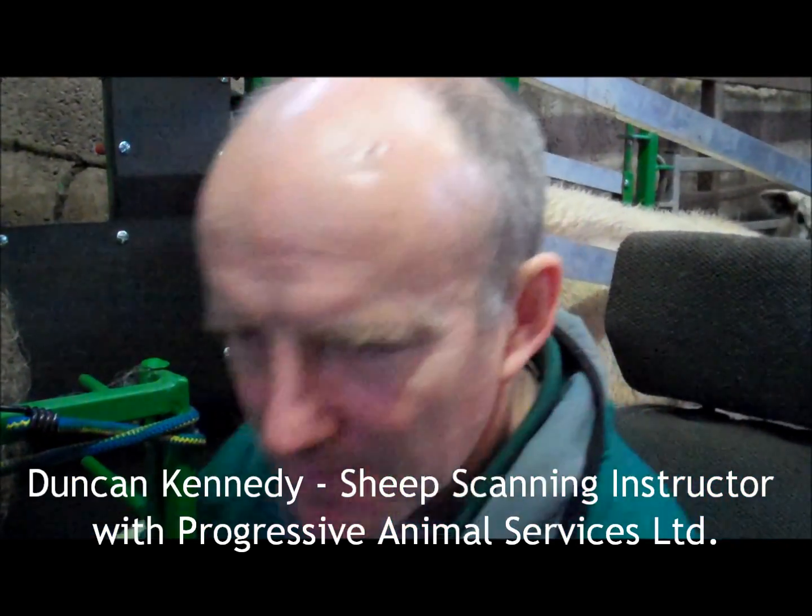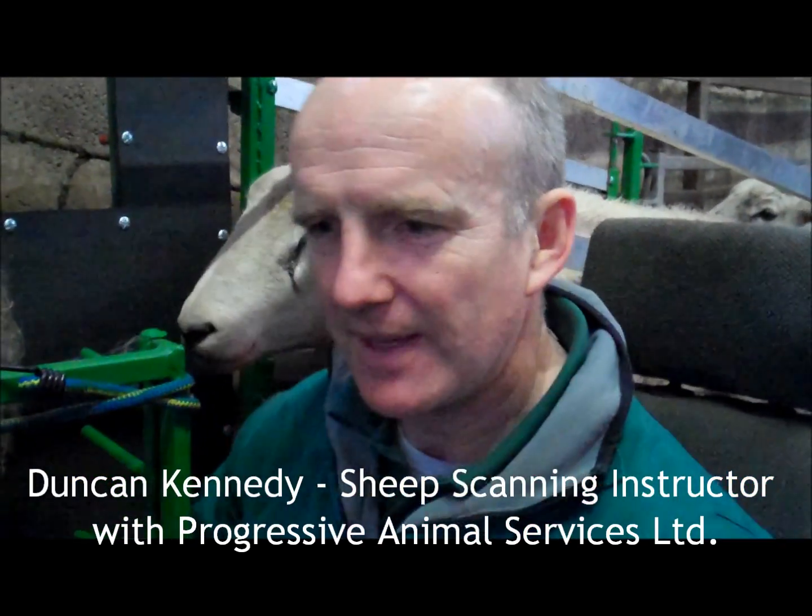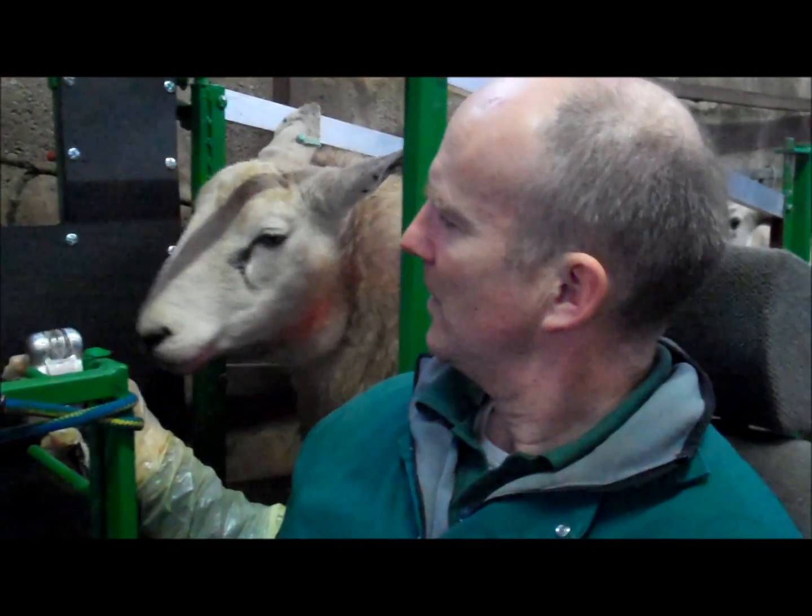The most important thing when you're scanning sheep is to have a good contact. We'll get that with a gel feed system. Gel onto the groin area of the ewe.